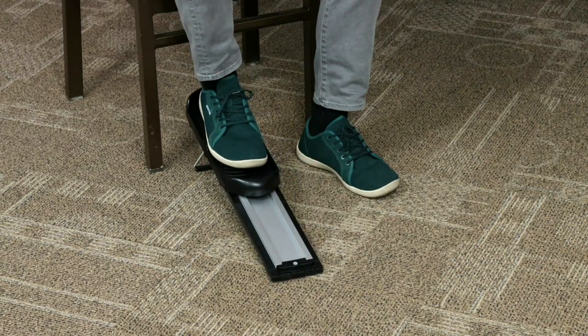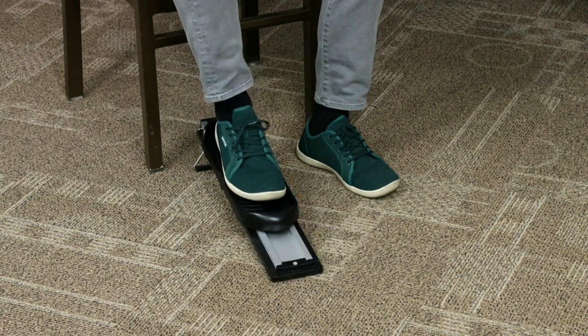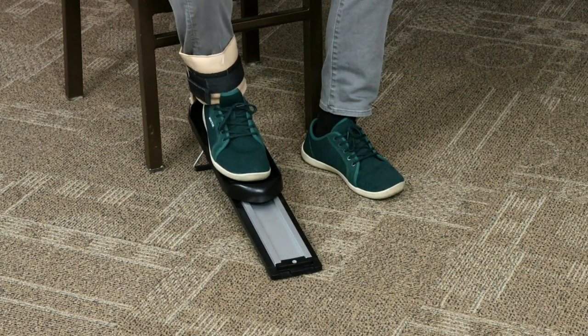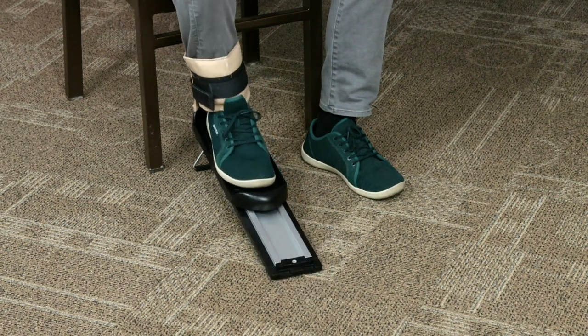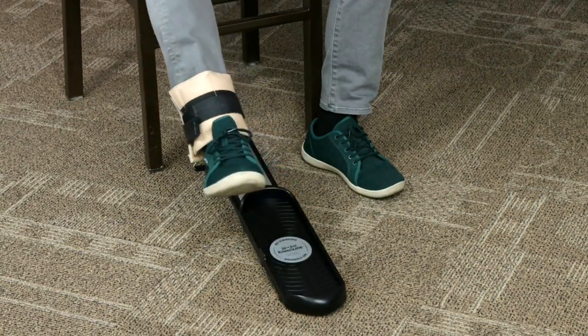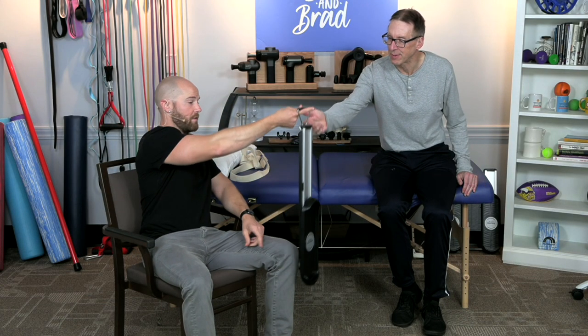A good way to make even more resistance with this is adding a cuff weight. This is three pounds, and this makes it a lot more challenging — going this way really hits the hamstrings. And the whole device weighs less than three pounds, so it's very lightweight.